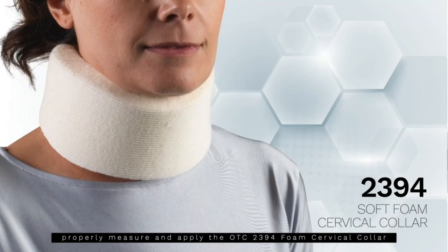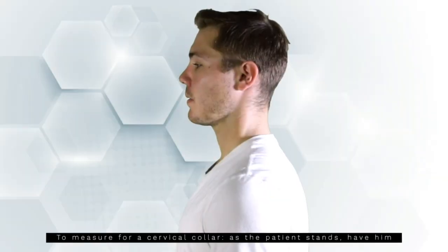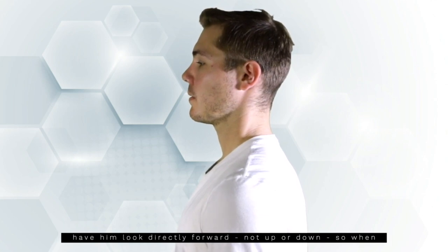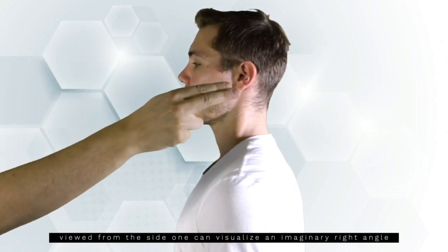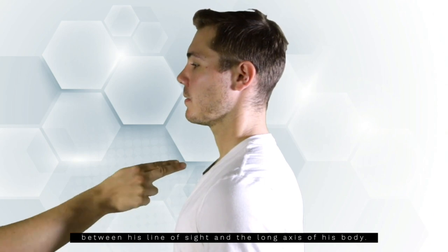This video will show you how to properly measure and apply the OTC-2394 Soft Foam Cervical Collar. To measure for a cervical collar, as the patient stands, have him look directly forward — not up or down — so when viewed from the side, one can visualize an imaginary right angle between his line of sight and the long axis of his body.